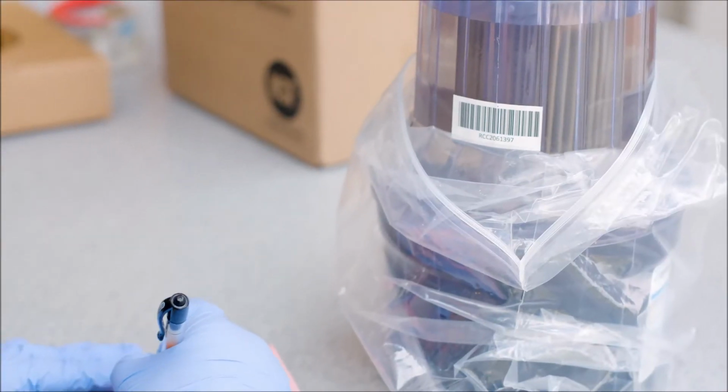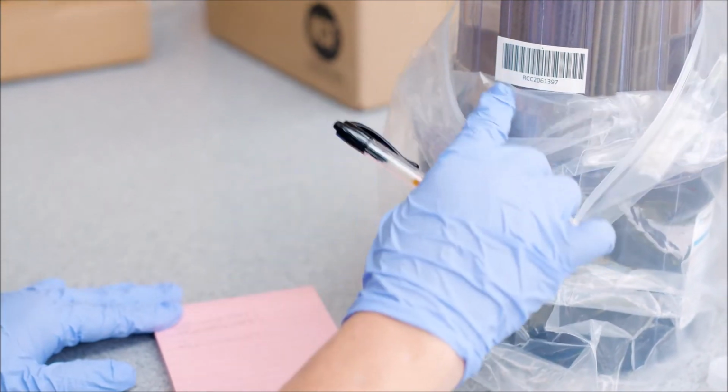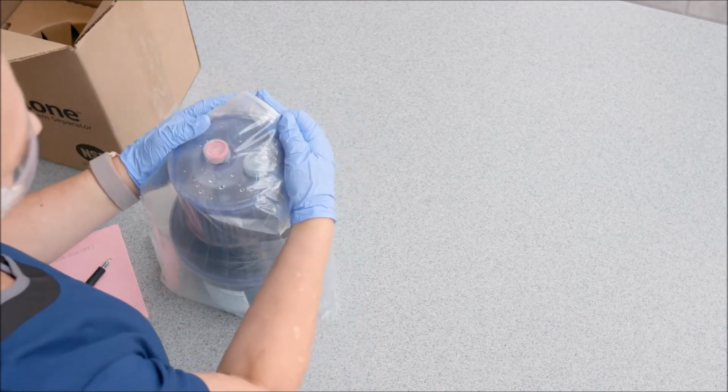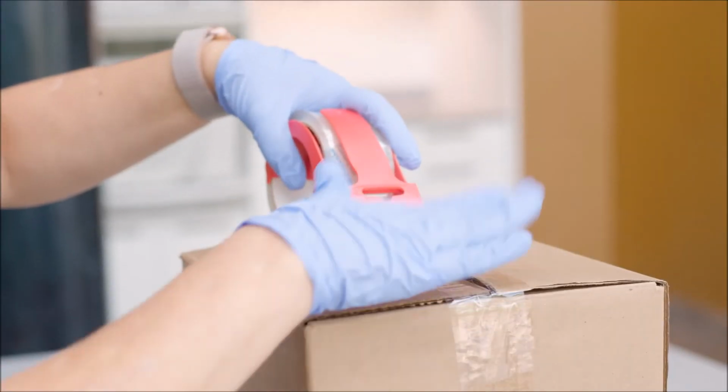You will need the serial number of the used canister to generate your prepaid shipping label. Squeeze out the excess air before fully sealing the Ziploc bag. The full canister should be securely placed in the box that the new canister came in.